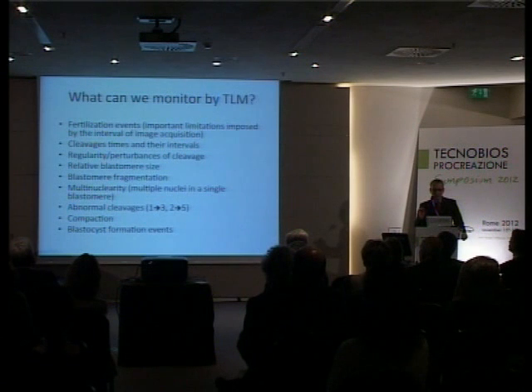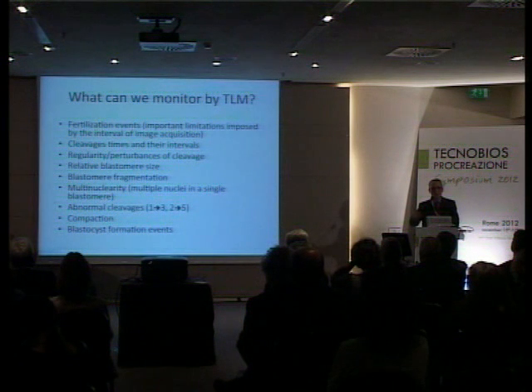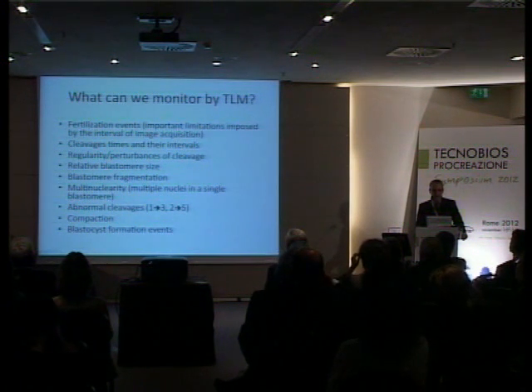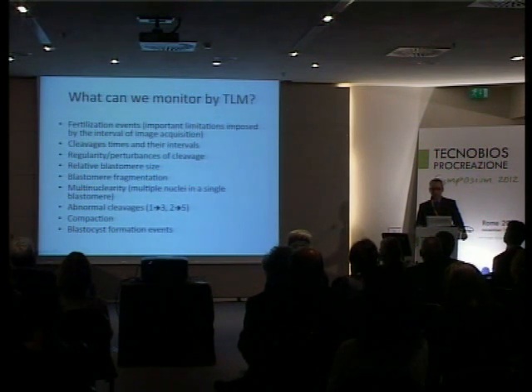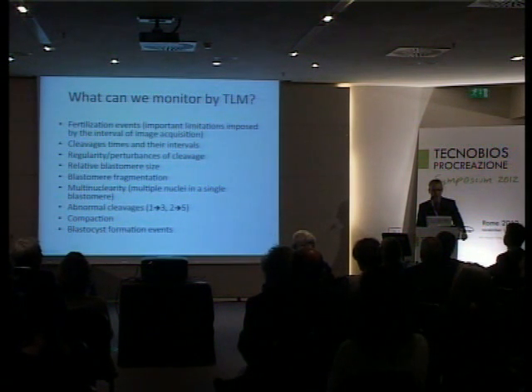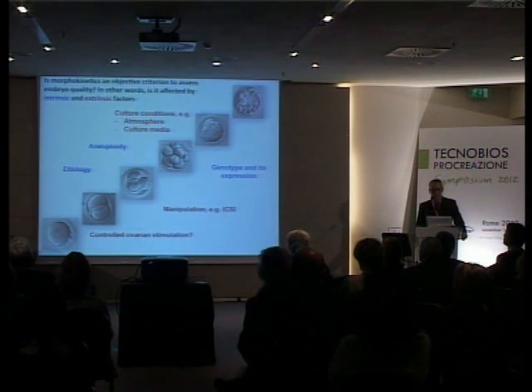We can precisely determine cleavage times and their intervals, regularity or perturbations of cleavage, relative blastomere size, blastomere fragmentation in a dynamic fashion, multinuclearity, in other words multiple nuclei in a single blastomere, and abnormal cleavage, which is a phenomenon that was suspected to be happening but not entirely documented. And of course, we can also establish better times for compaction and blastocyst formation events, especially during the 9 hours in which embryologists are not supposed to work.